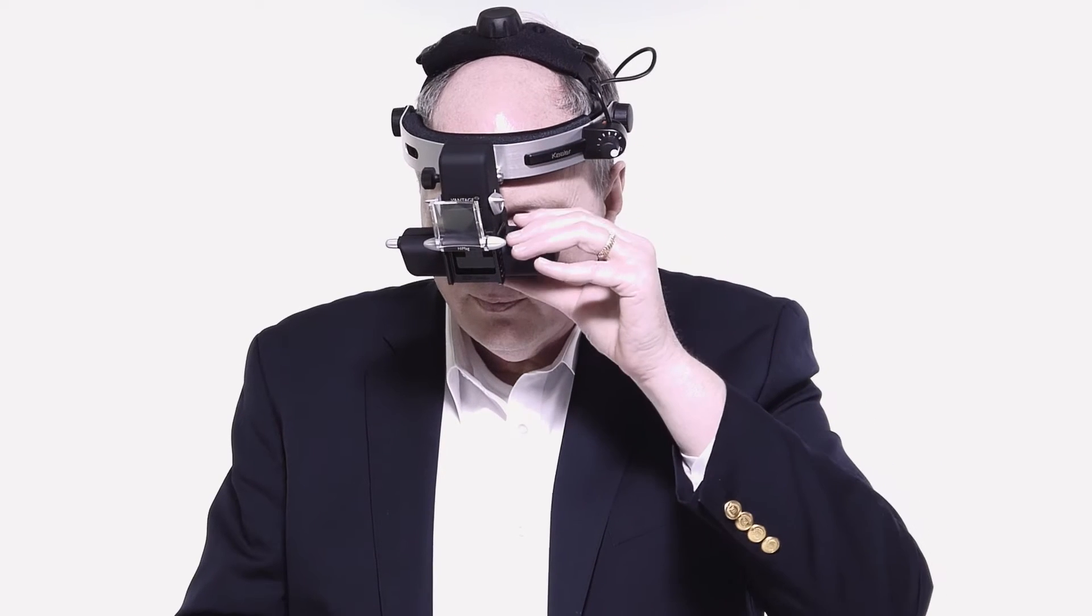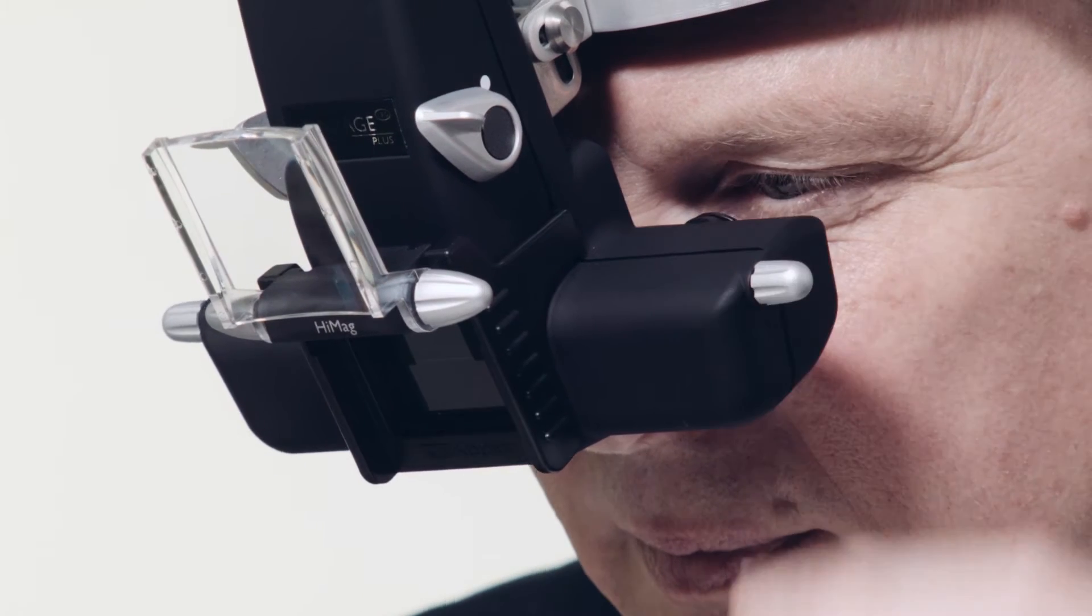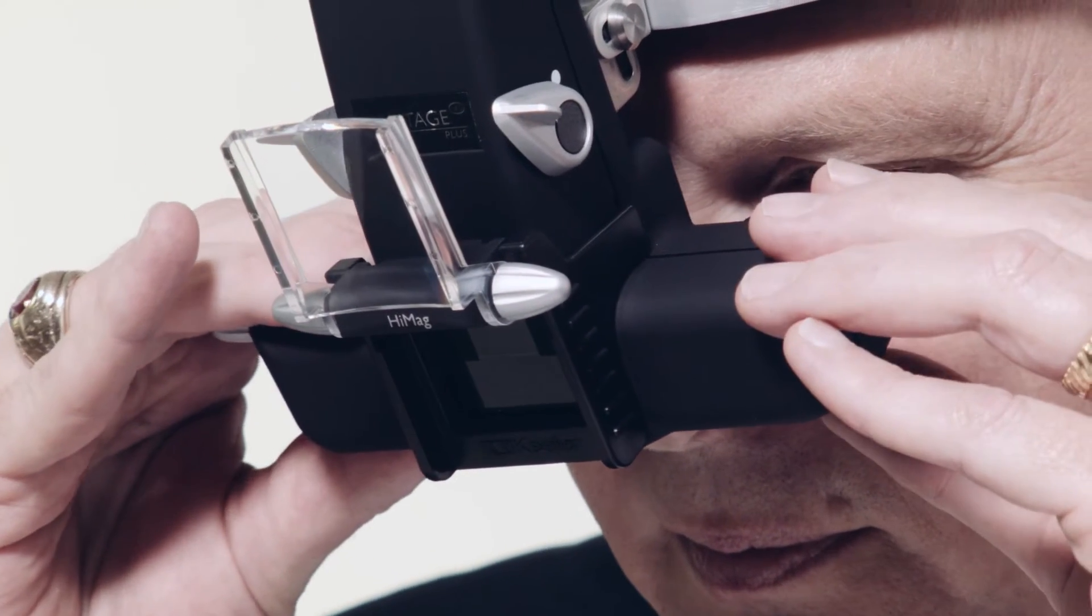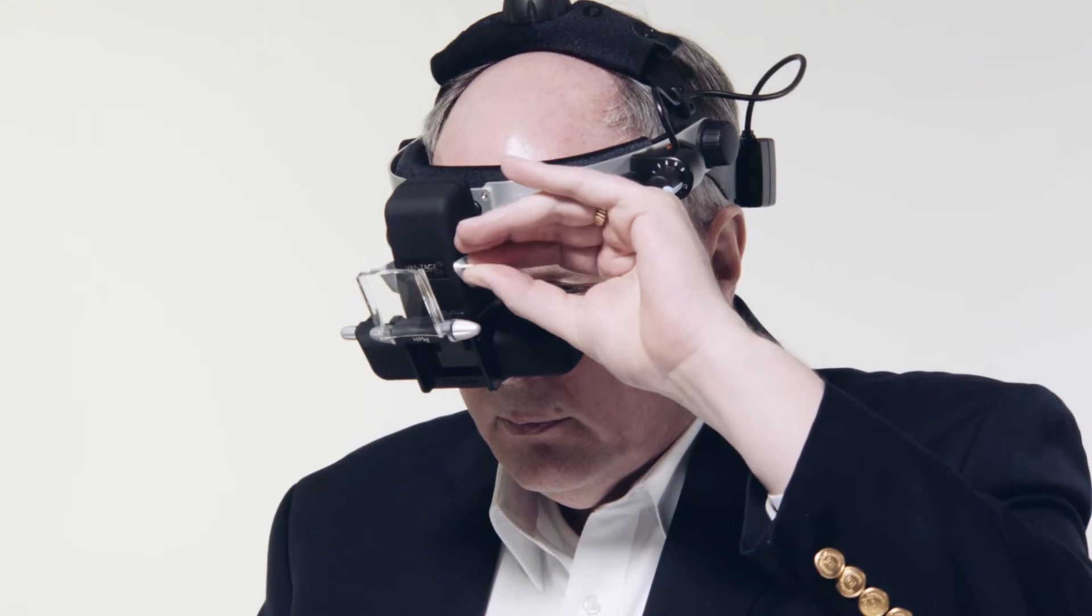Because eyes are dissociated, pupillary distance, or PD, must be set for each eye. Simply slide one ocular at a time and make sure the image is fused. The Vantage Plus features three aperture size options.